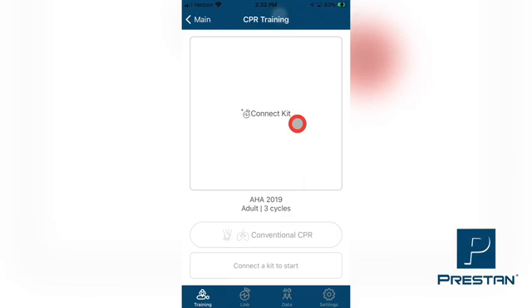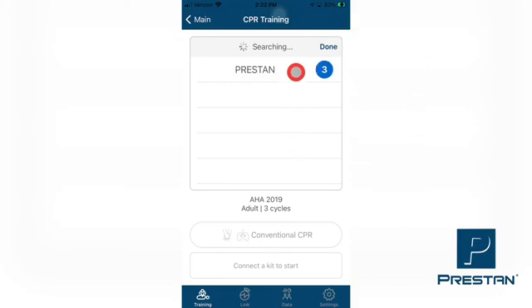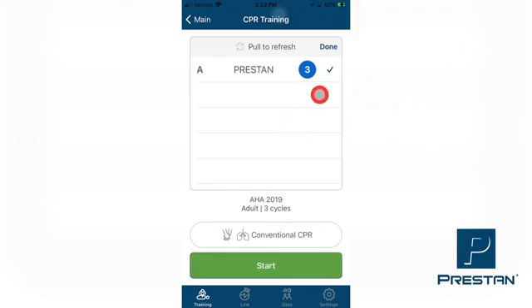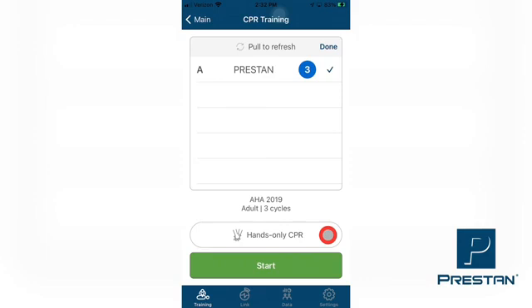On the next screen, select Connect Kit. You will now see that your device is searching for any active Preston Adult Professional Series 2000 mannequins in your immediate vicinity. Once the list of mannequins appears, select the mannequins you wish to connect to. When the mannequin is connected, you will see a checkmark appear next to the selected mannequin. Once all the mannequins are connected, you can select your desired training method. The available selections are Hands Only, which is the method where the students will perform compressions only, with no ventilations.